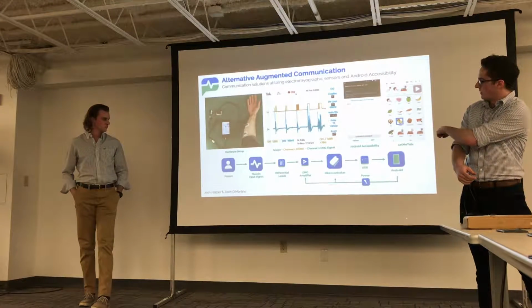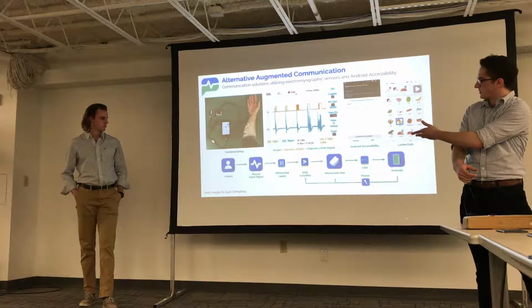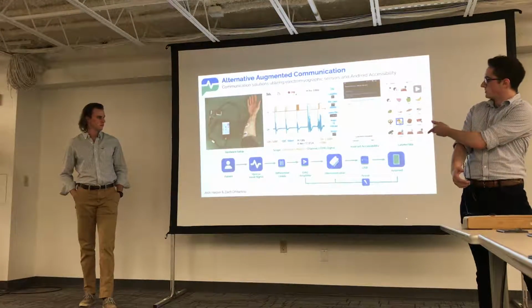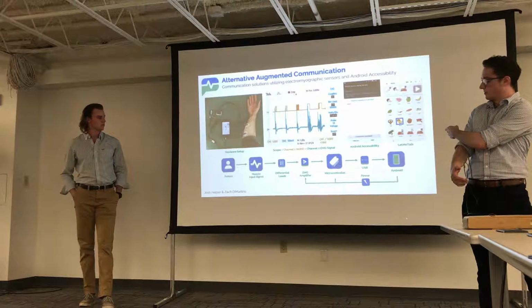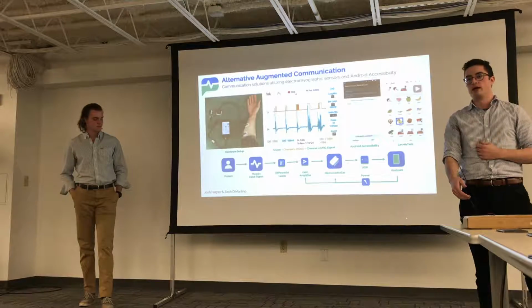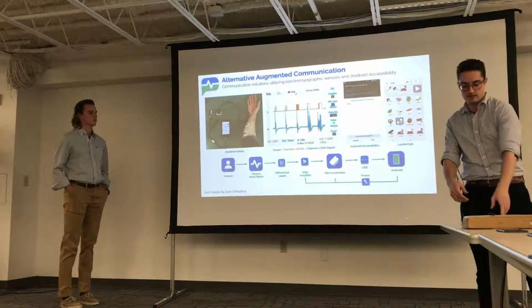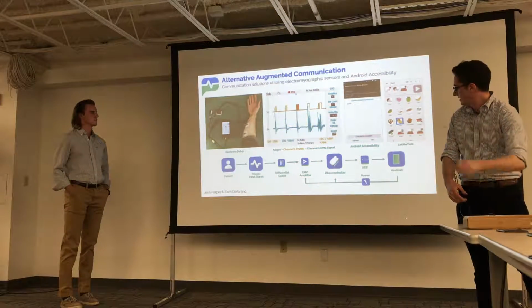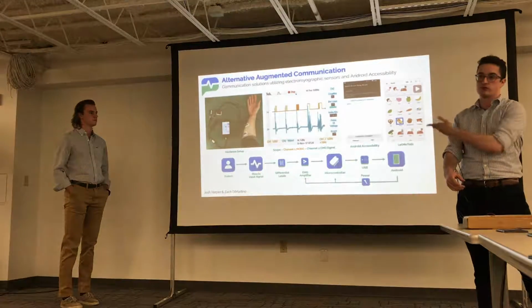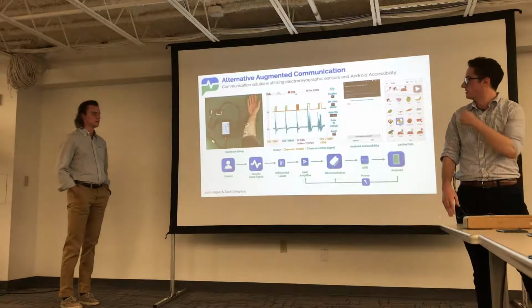On the bottom is a basic outline of our device. We connect our patient with some differential leads, as you can see here. That gets passed into an EMG amplifier, which is sent to a microcontroller. Currently we're using an Arduino, but we're hopefully going to transfer it to a PIC later down the line. That connects to an Android smartphone via USB, which also supplies power to the EMG amplifier and to the microcontroller itself. So it's a completely self-contained system. And Josh can explain the specifics.